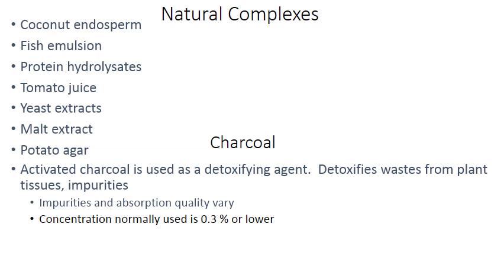Coming to the natural complexes, coconut endosperm, fish emulsion, protein hydrolysates, tomato juice, yeast extract, malt extract, and potato agar are some of the natural complexes utilized in tissue culture media.